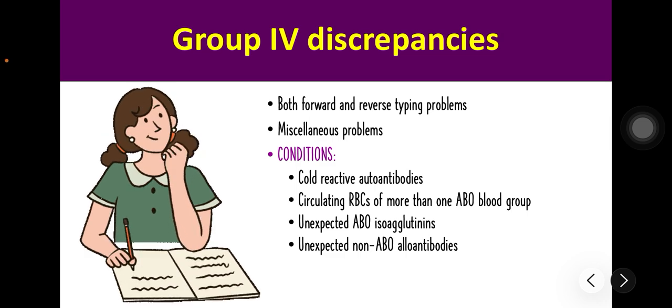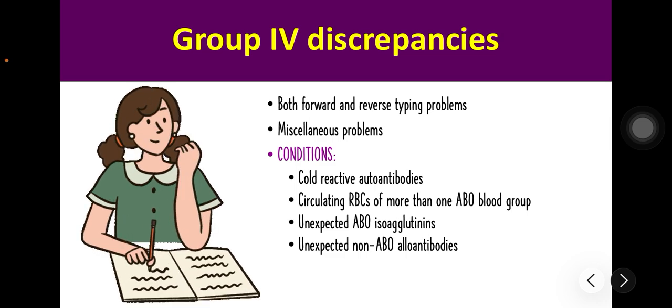Next, we also have the reagent dye sensitivity. Some individuals have an antibody against acriflavine, which is the yellow dye used in anti-B reagents. This causes the patient cells to clump when the reagent is added, even if they aren't group B.